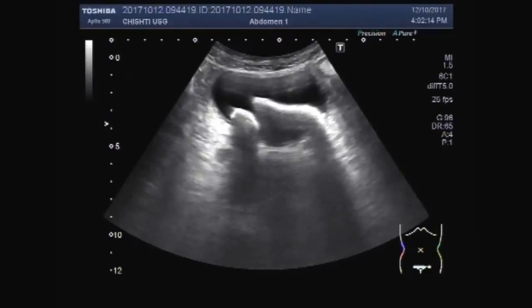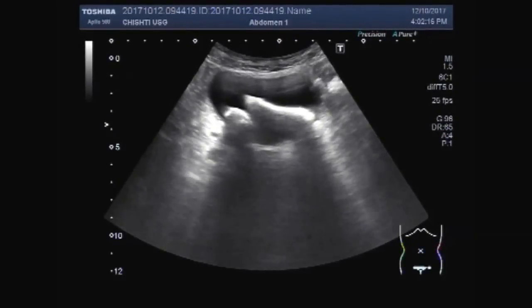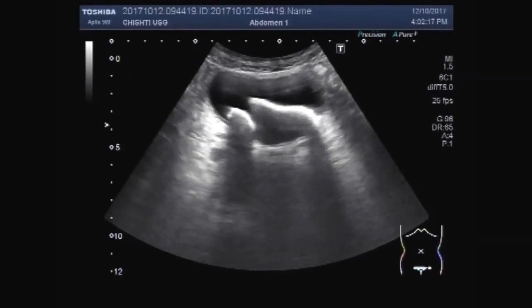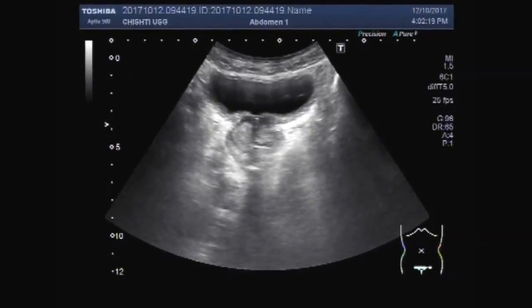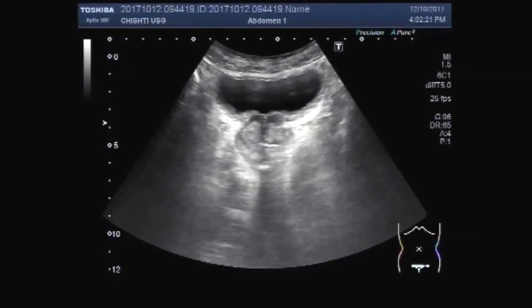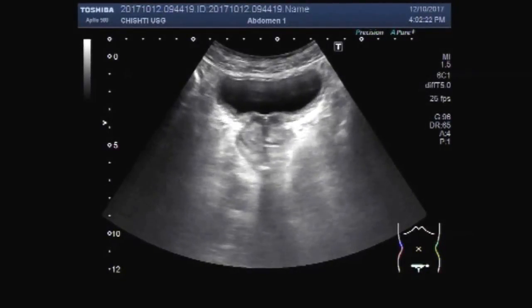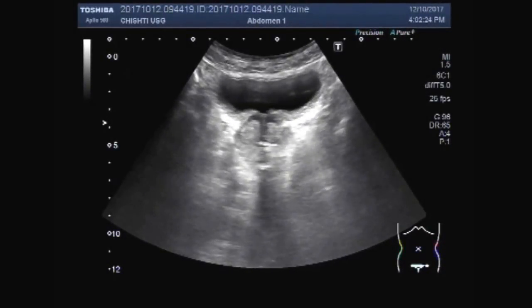Yes, these are two large stones inside the urinary bladder. Now we are going to see the prostate. We are going to focus the prostate gland.